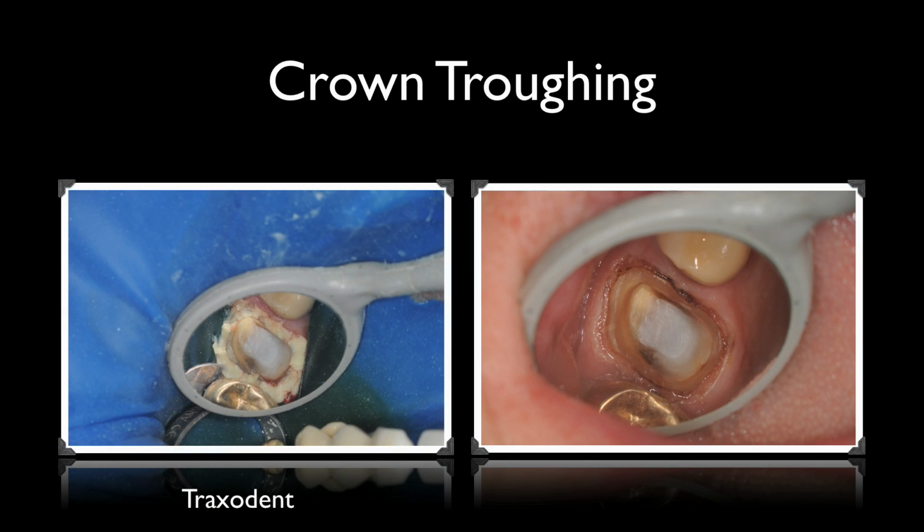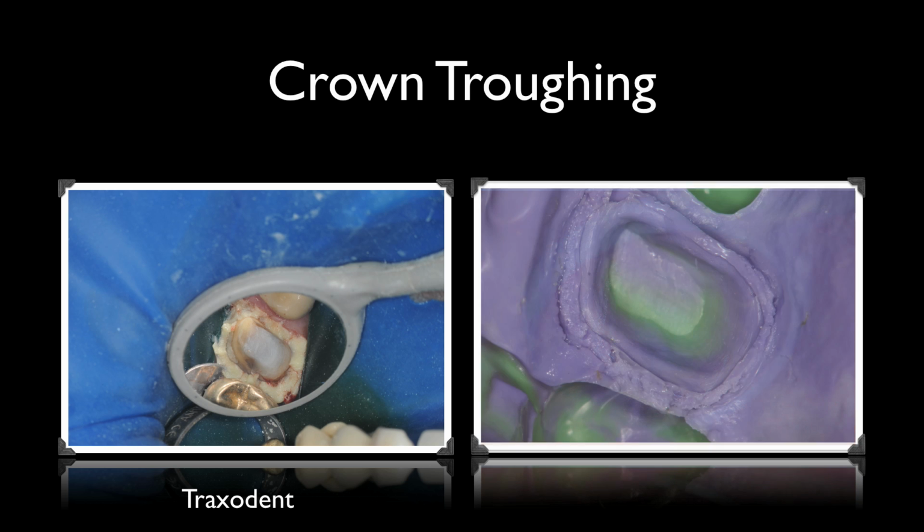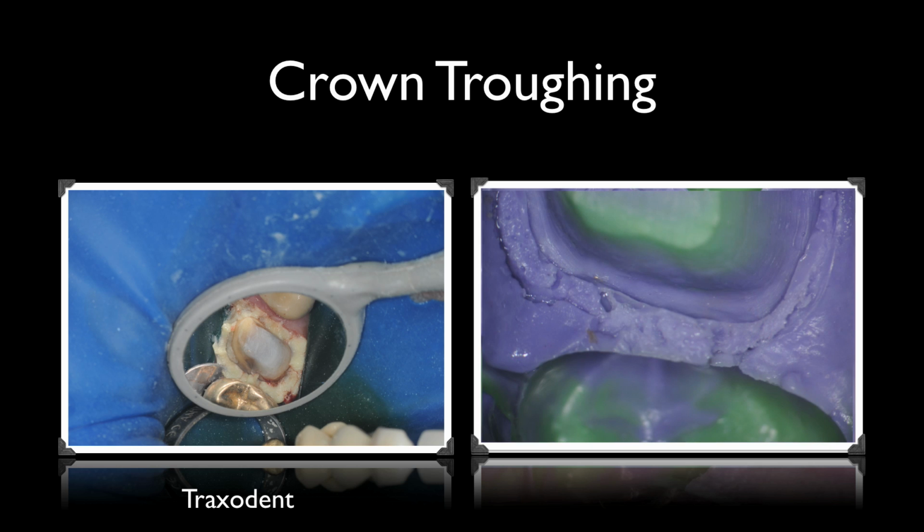The impression is taken, and you can see on the right hand side the impression, and it gives you a clear view of the margins at high magnification, and the patient then is provisionalized and will be sent away. So I want to finish with that particular case, and this is a second case, and I'll deal with this one in a later movie for you.